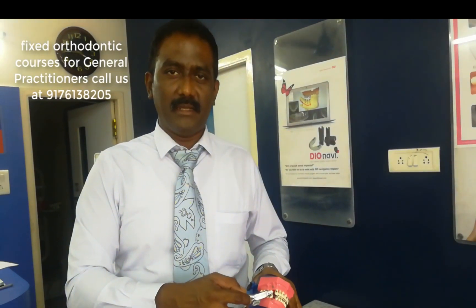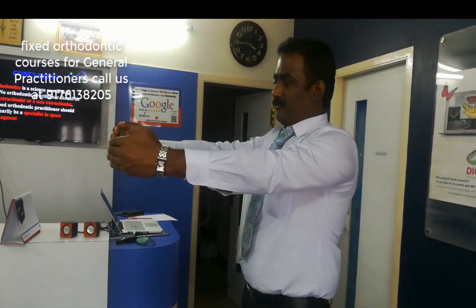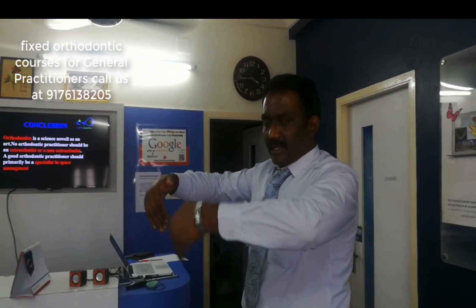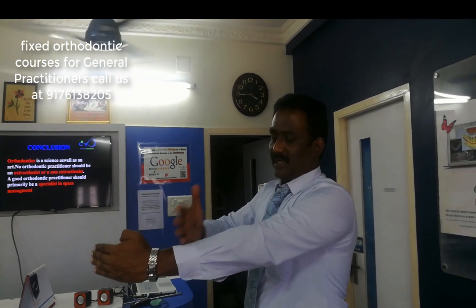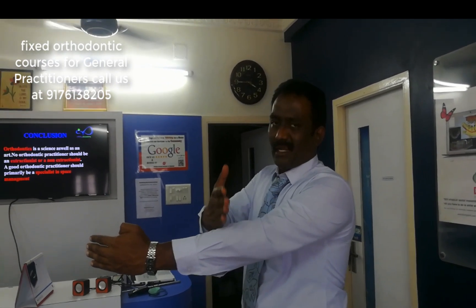We have to give a bend in the wire, because if you don't give a bend, when you are doing retraction, the force factors can cause unwanted movements — uncontrolled tipping — where the root can come out and the incisors can go inside. To avoid that effect, we need bodily movement and controlled tipping. So in the middle portion of the extracted side, between the canine and the first premolar extracted space, mark it in the middle and give a 45-degree bend called a gable bend.